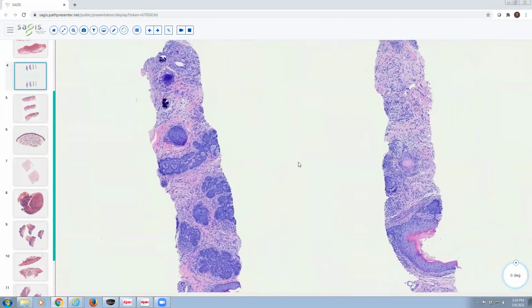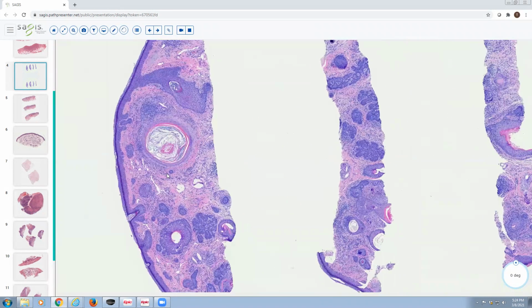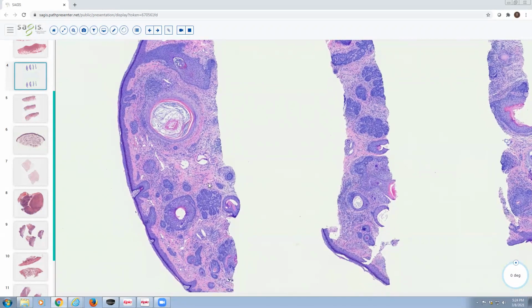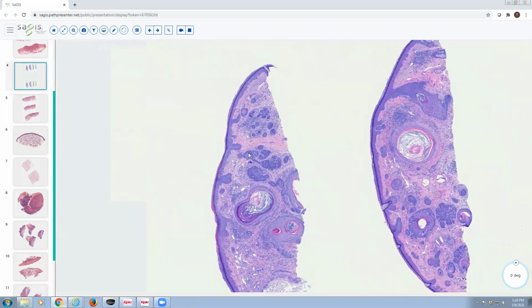And if you're reading about trichoeps, you might see some comments about the immunohistochemistry that can be used to differentiate them, and I want to just describe what you could find. Generally speaking, I don't think that immunohistochemical stains are necessary or a huge part of the workup for these, but in rare instances, especially in small samples, they can be helpful to make your differential diagnosis.